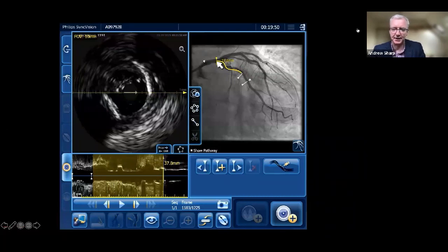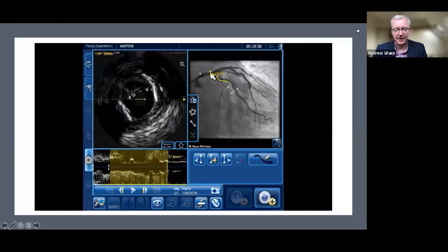So as we're scrolling here, I'm looking and saying, where would a 38 millimeter stent land? And then suddenly this thing appears. And then we pause for a moment and go, hang on a minute. So I think I was looking down during the live pullback at my hands. And so I hadn't seen it on the first run. But there's a surprise there. So you can see from the co-registered angiogram where we are on my arrow. We're in the left main. And this is what we're looking at in the left main. So I'm sure you're all wondering quite what that is.